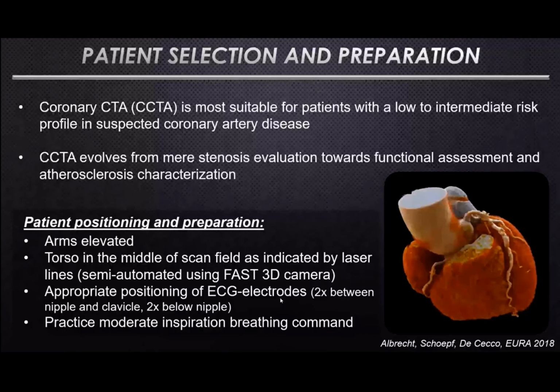The torso of the patient is in the middle of the scan field and gantry. This is indicated easily by the laser lines from the scanner and can also be performed semi-automated using the fast 3D camera, which makes this part potentially faster and more consistent for each patient.